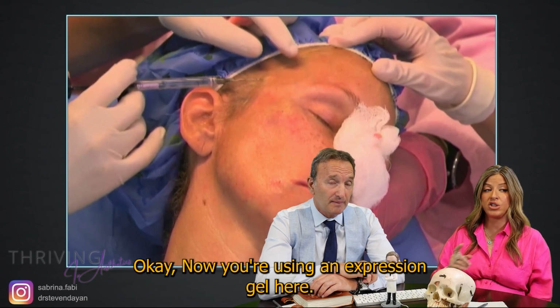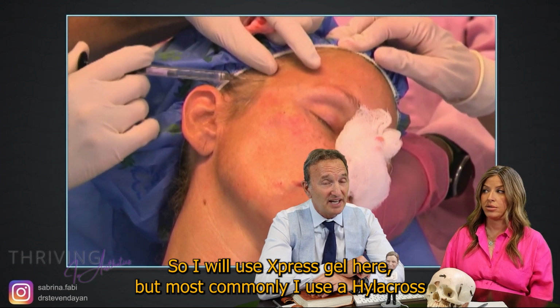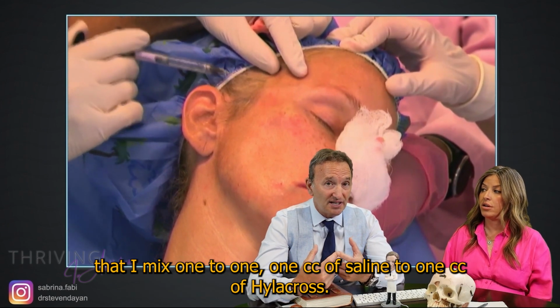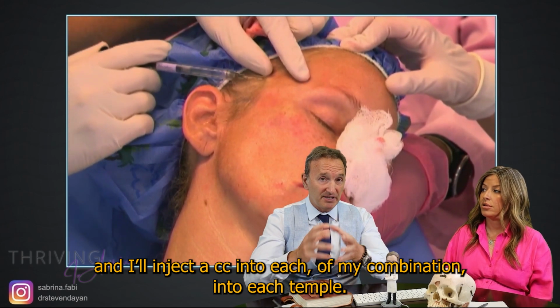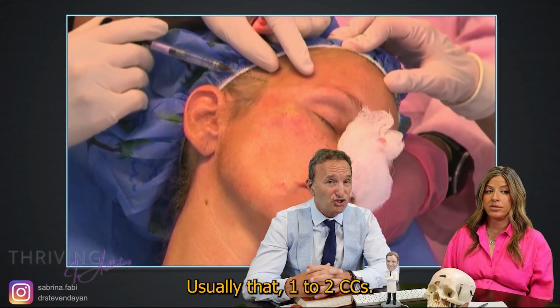Okay, now you're using an expression gel here. Are you blending it? So I will use express gel here, but most commonly I use a hyalocross that I mix 1 to 1. 1 cc of saline to 1 cc of hyalocross, and I'll inject a cc of my combination into each temple. So 1 cc of blended product into each anterior temporal fossa. Usually that's 1 to 2 cc's.